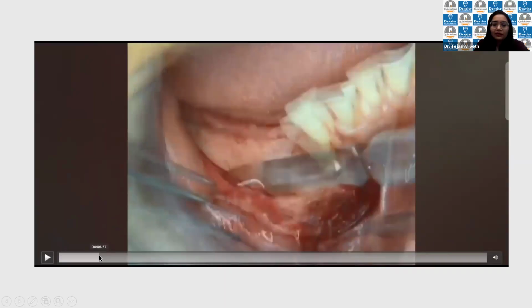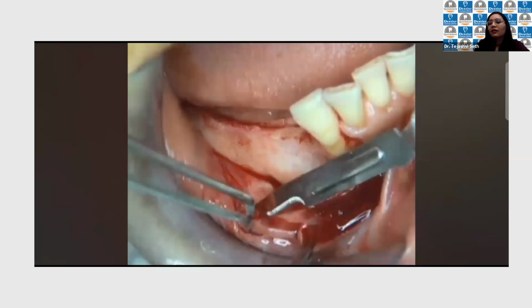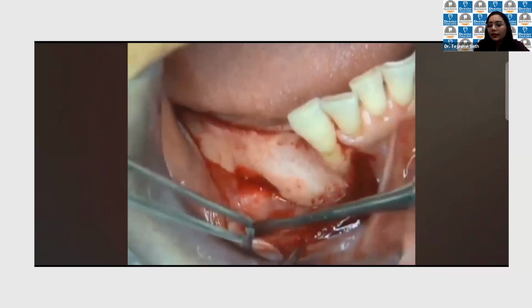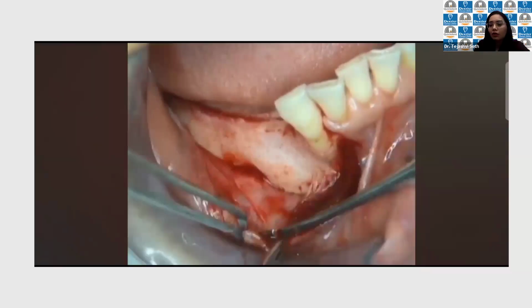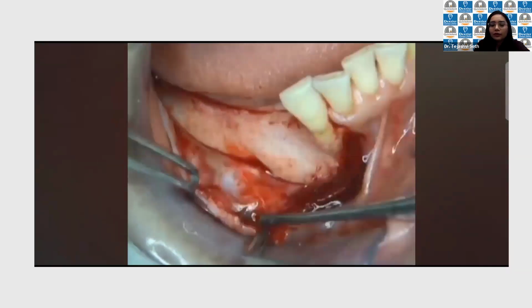Like at the start, it had quite a lot of tension. And if you're doing any procedures, it will be very difficult even after implant placement to cover that. If you're doing a submerged implant placement, or even if there's no augmentative procedure, the closure is important.